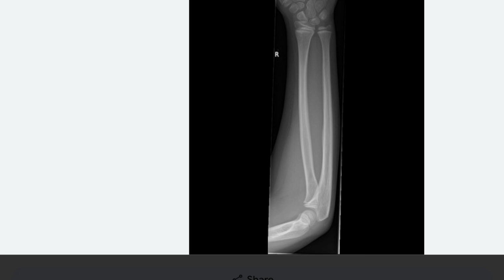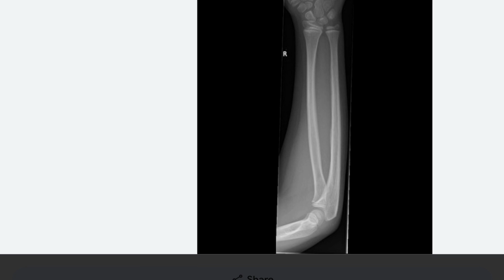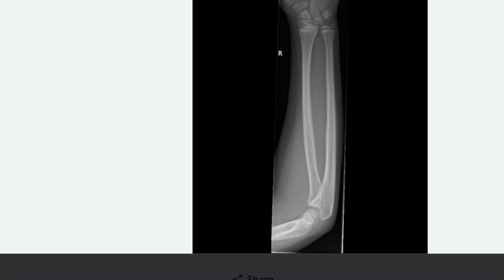Displacement, mention translation, angulation, rotation, lengthening, shortening, overlap. Geometry of fracture line: transverse, oblique, spiral, butterfly fragment, wedge, comminuted, segmental, bone loss. Extension into joint: intra-articular fracture, impaction, comminution, condylar or volar dorsal displacement, displacement of fragment, and shift or tilt of joint.